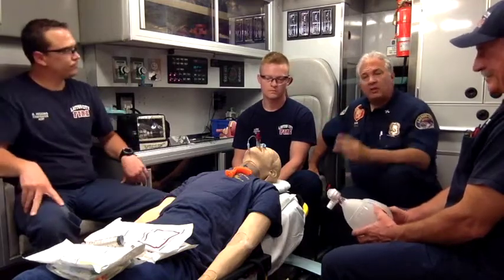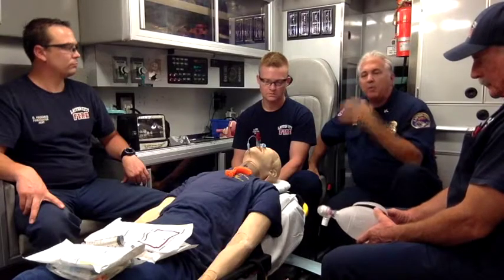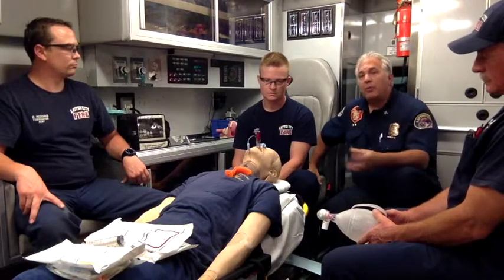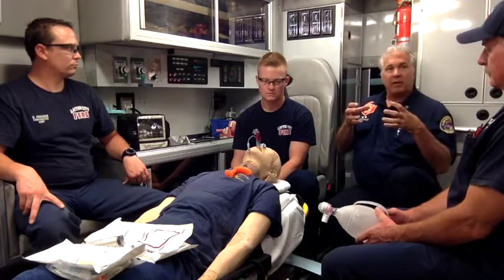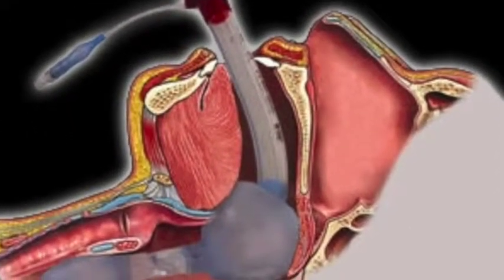But when it comes to these, there are two important studies that, again, it mentions in there. I'm not going to beleaguer it too much, but I used to reference it all the time. There was a pig study that was out for years and years, and it was the first generation, the big combi tube ones that it specifically looked at. What it found was that when they inflated that great big cuff at the top of it, it would push that tissue away, which is how it got its seal.